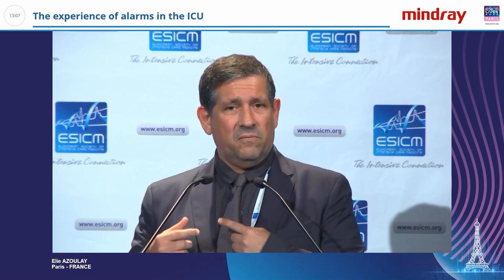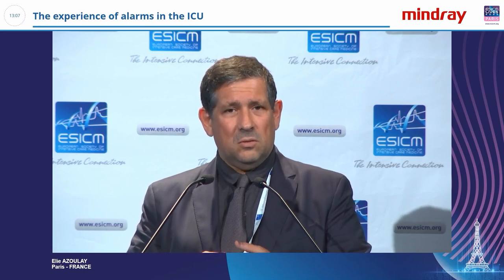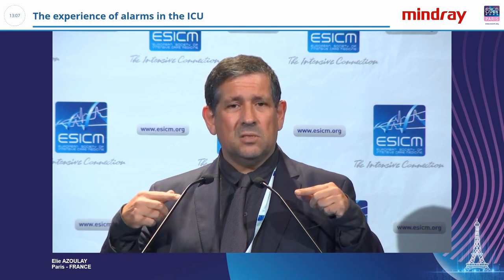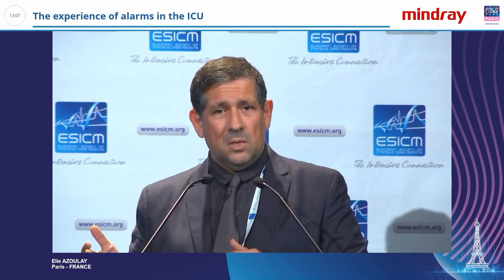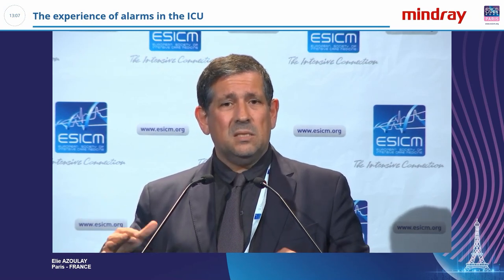You need to find something that has to be discussed at a unit level with the nurses and with the entire team so that everyone will have an understanding of the same alarms. For example, in your ICU and mine, we don't behave the same way when controlling alarms. And it's not a problem that for some alarms for which nurses are mastering the problem, it takes maybe 2 or 3 minutes to control the alarm.